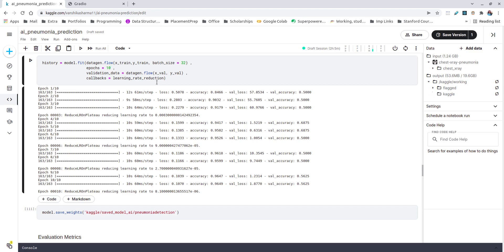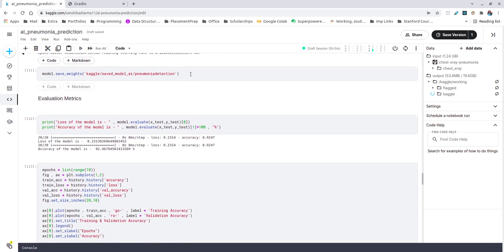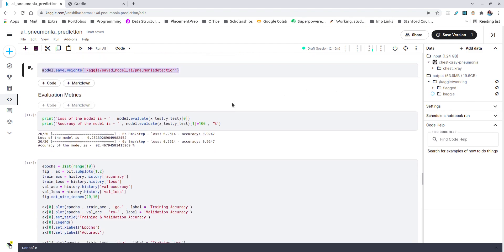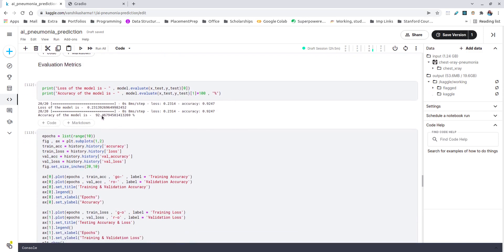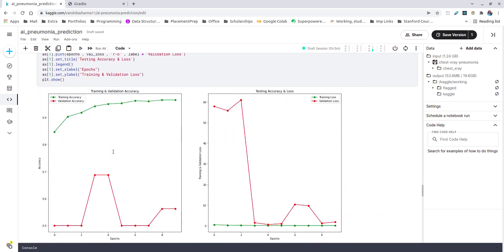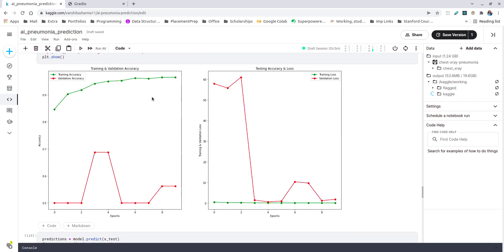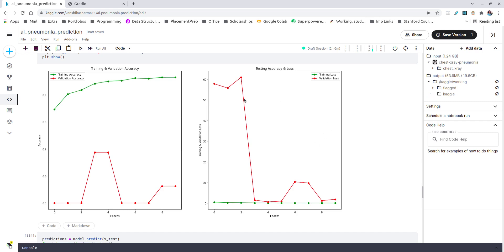The accuracy of my model comes out to be 92.46% and the loss comes out to be 0.23, which is pretty decent. Here in the cell I've tried to visualize my accuracy. This is the accuracy versus epochs curve, and this is the loss—testing loss and accuracy per epochs curve. In the training we can see that the training accuracy increases as we increase the epoch, but there comes a time for validation accuracy which is pretty strange. This happens because of the data variation and augmentation that we do for processing. But in testing we can see that the loss, the training loss, remains a little constant, which is a pretty good thing because it's pretty low, and the validation loss faces a steeper slope on the loss side.